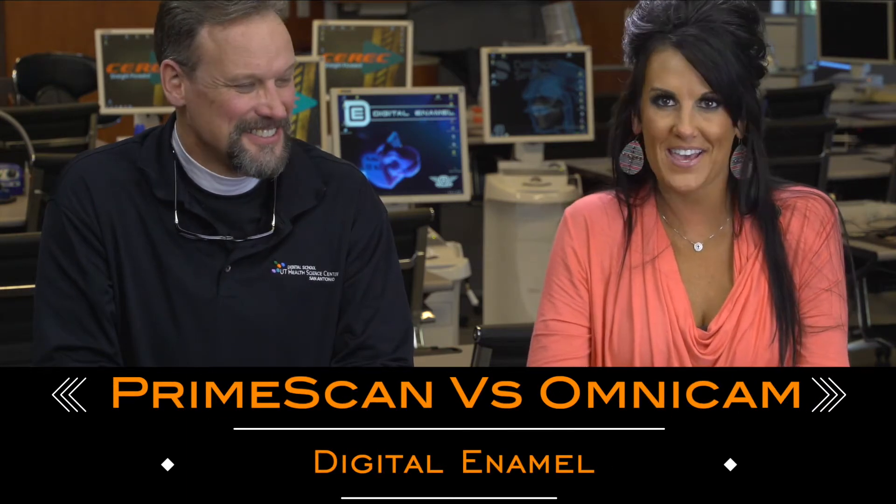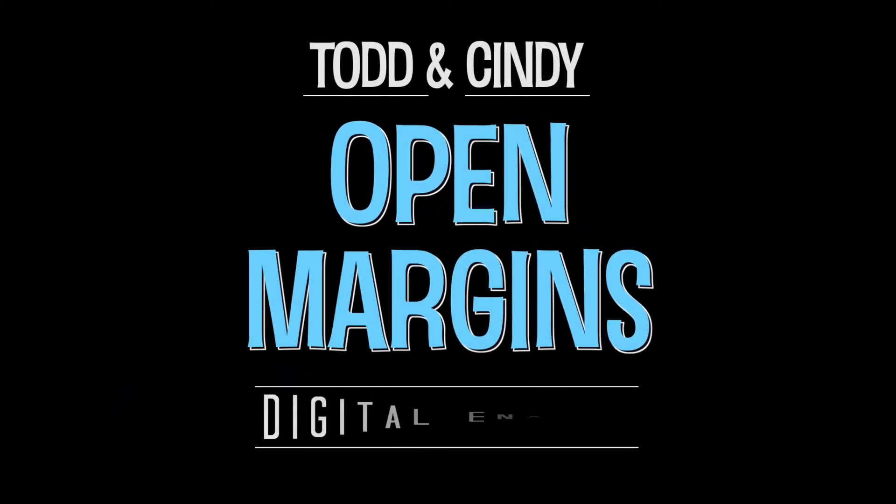PrimeScan versus Omnicam. We've had a lot of questions about the difference between the two — should we upgrade, is it really that big of a difference? Well, we've had a unique opportunity because we're right at a year of use with the PrimeScan.